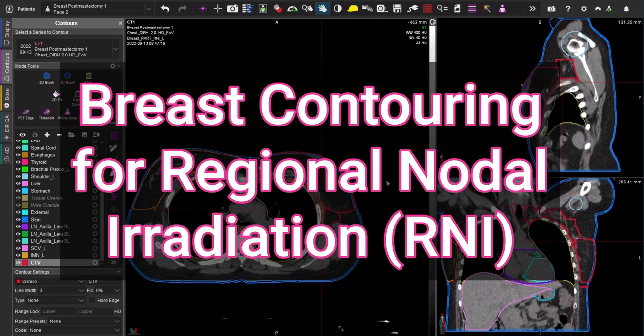What is up YouTube? Today we are going to contour breast regional nodal radiation, and this is going to be a post-mastectomy case, left-sided.